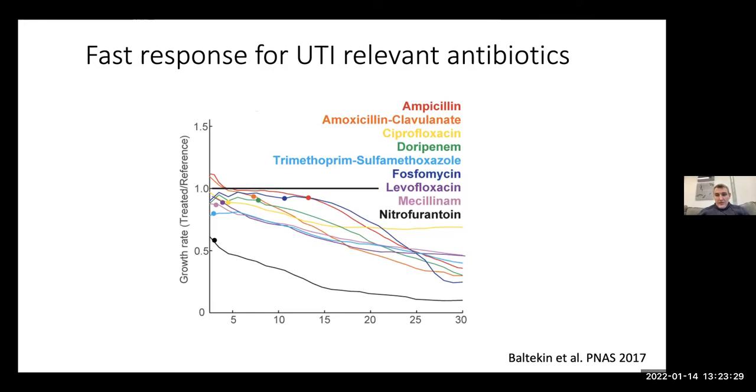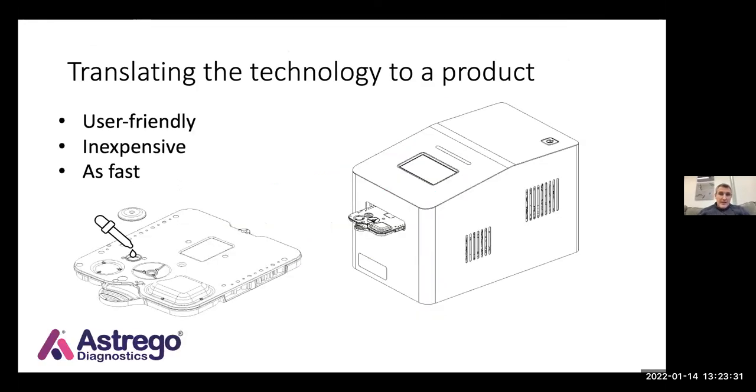But this was a very complicated assay, and to make it into the clinic and actually useful for anyone, it needed to be much more user-friendly. So it doesn't require a PhD level operator that has been trained for this for years. It also needs to be much more inexpensive.